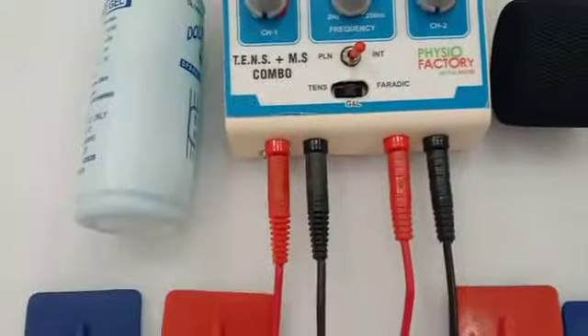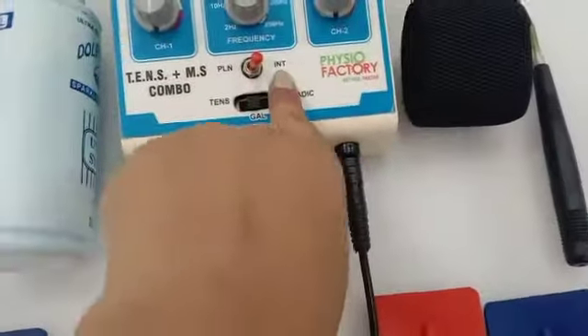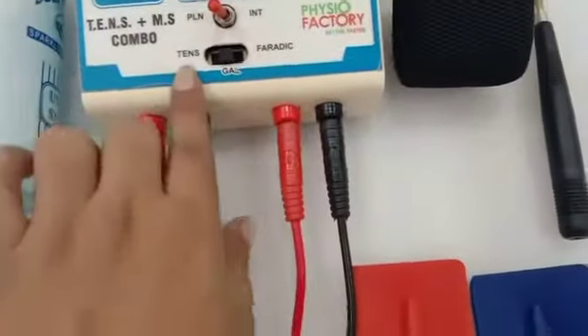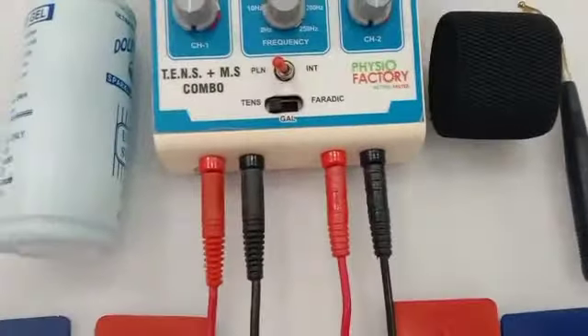As per your requirement, you choose whether you want plain current or intermittent. I'm using plain, and now I'm using TENS. Let me increase the first channel.